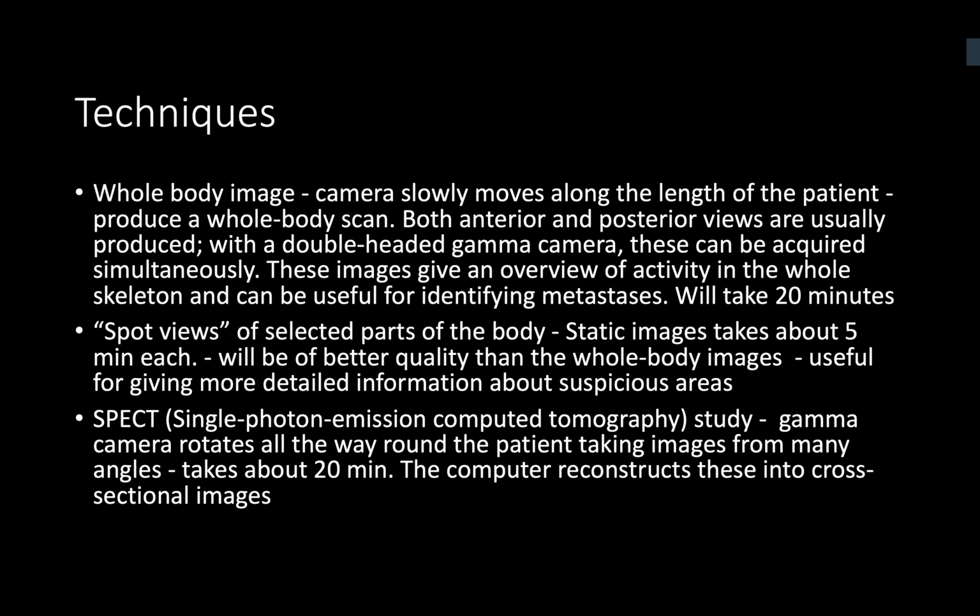Okay. And are you aware of the different techniques by which the bone scan is taken? I'm taking it a bit further because it's a discussion and it might not come in the exam, but if you know more, it is better, isn't it? So that's why I'm pushing a bit more regarding the bone scan, because that's the one we usually prescribe for almost all relevant persons who have a clinically significant prostate cancer. So do you know about the techniques by which we can obtain the bone scan images?